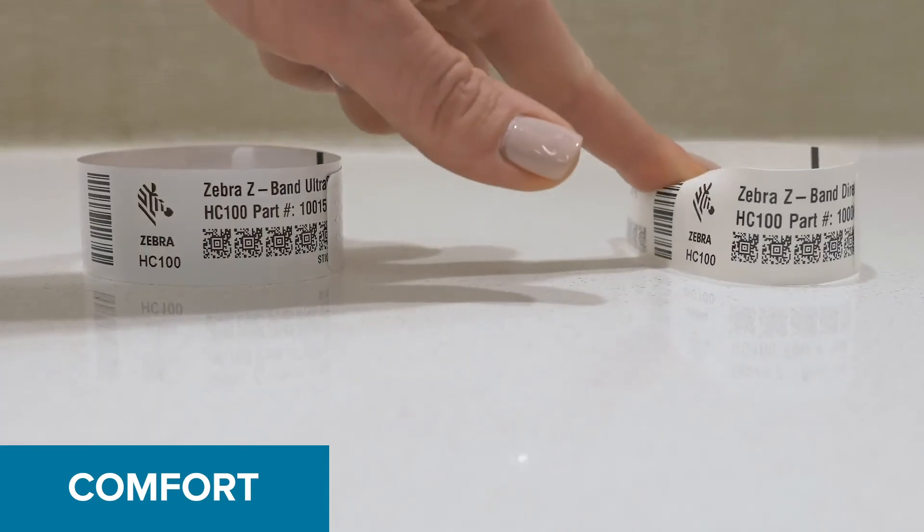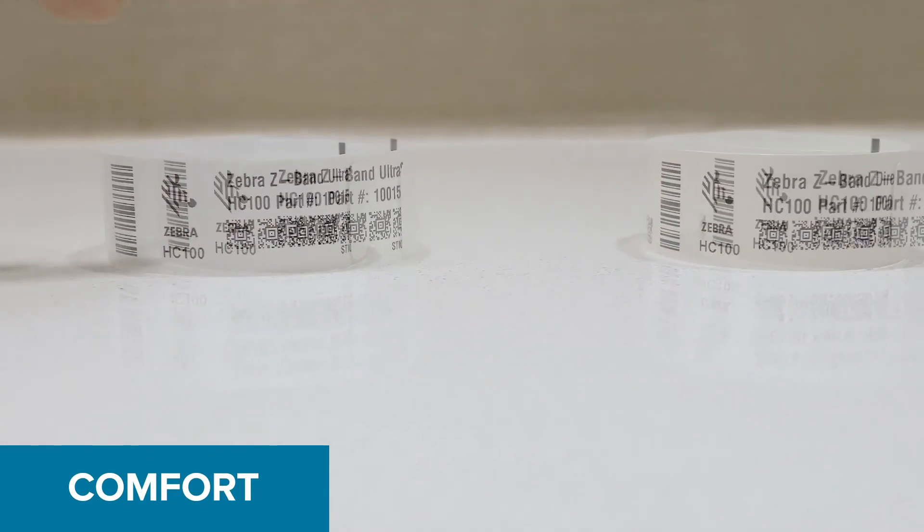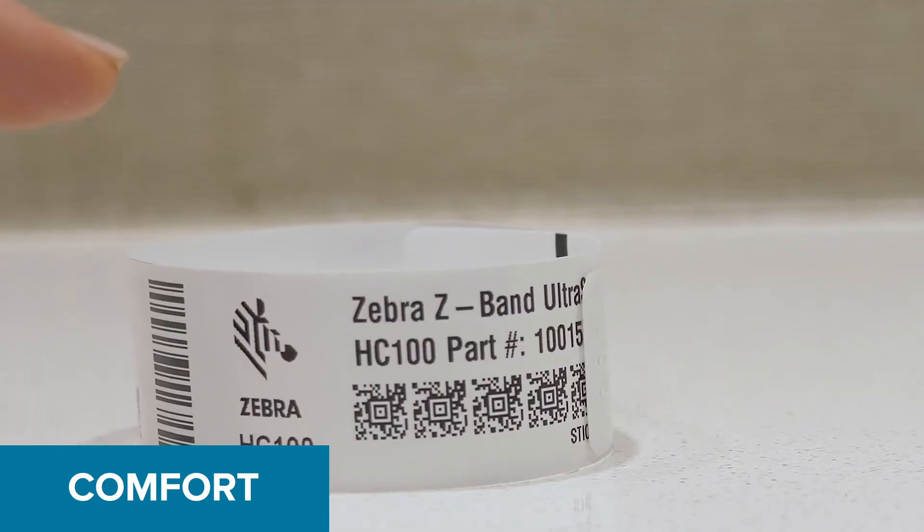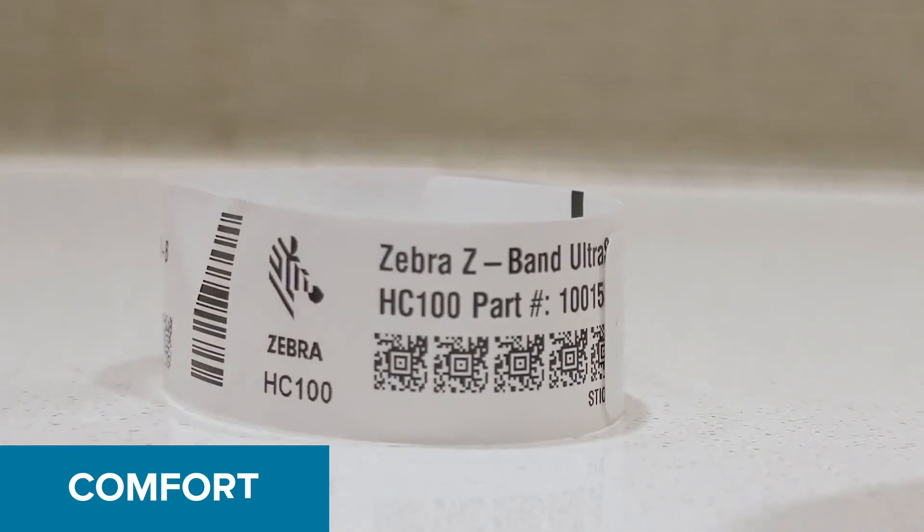Our Z-Band UltraSoft wristband is the softest available, ensuring patient comfort without sacrificing quality. In addition, Zebra offers a host of soft infant solutions.